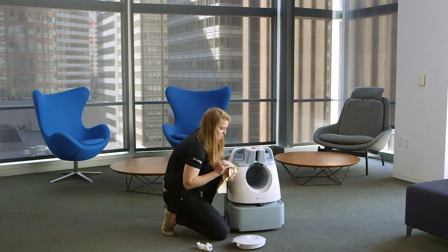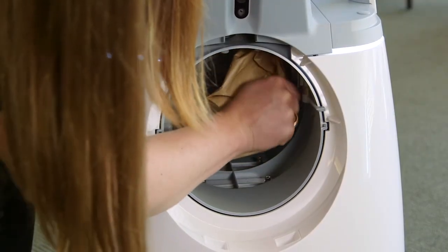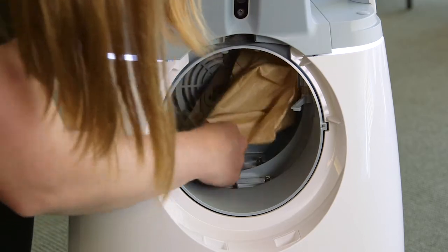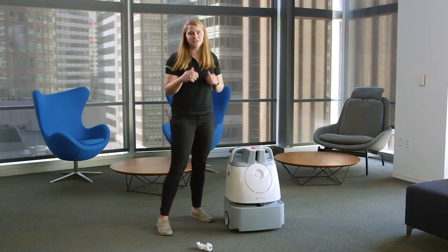Then I'll put the bag back on, and slide the lid back on. And you're good to go.